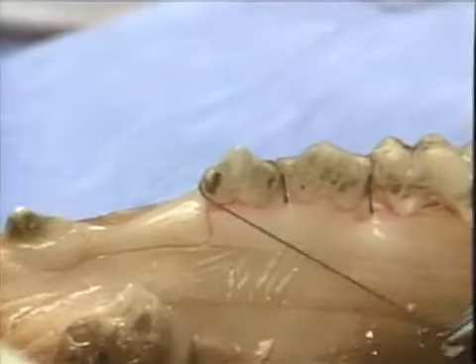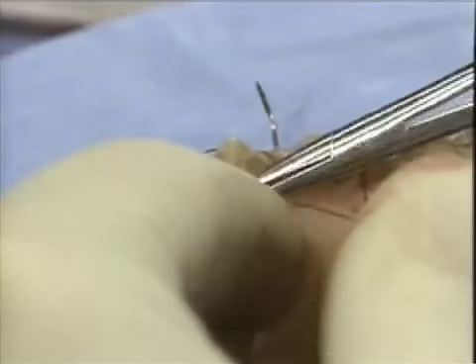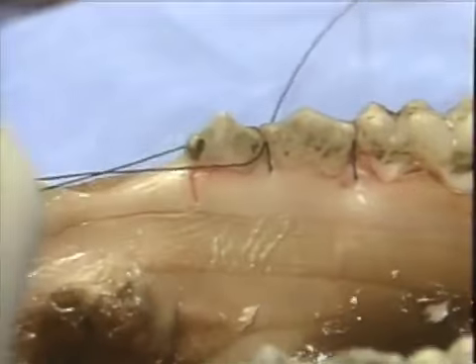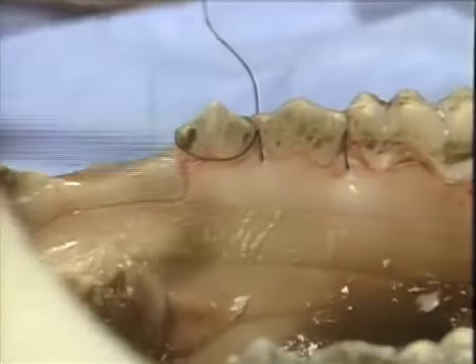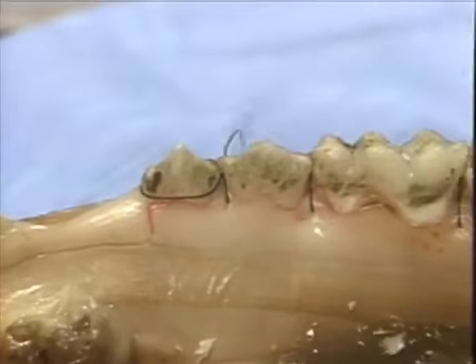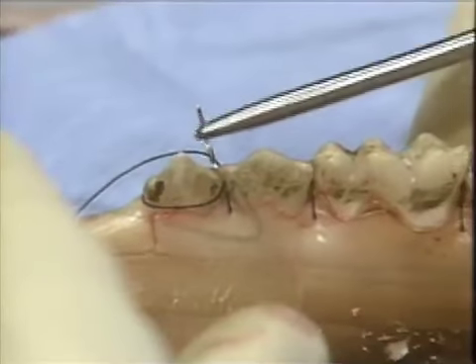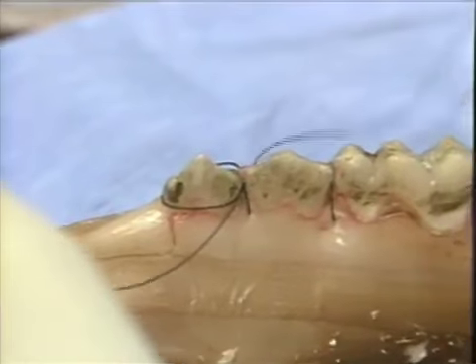The lingual flap can be independently sutured by knotting the sling suture at its terminal end by simply looping the suture around the terminal tooth either once or twice, picking up a component of that suture and tying a secure knot in this location. However, before the knot is secured, the tension on the lingual flap should be checked to ensure that the lingual flap is in its desired location before the suture is tied.